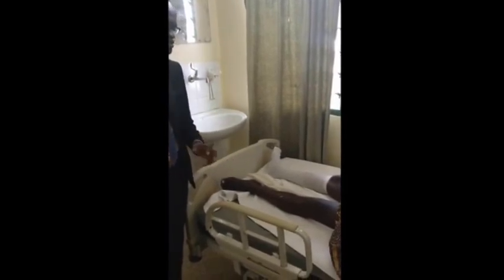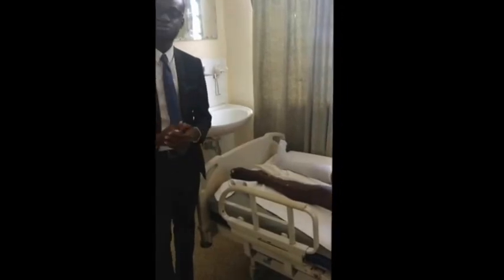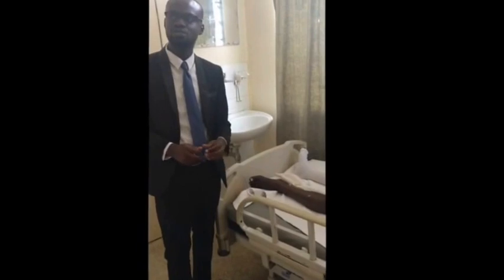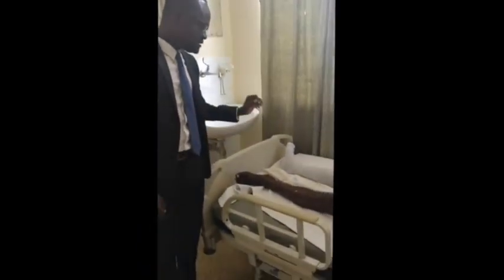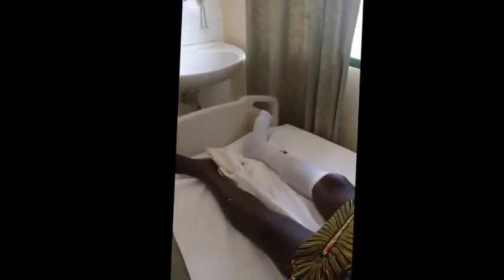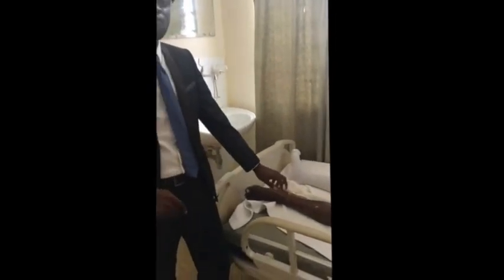In measuring, it depends on the type of anti-embolic stocking that you want to prescribe for the patient. Commonly on our wards, we prescribe the knee length anti-embolic stockings. With the knee length stockings, all that you need is the length of the leg from the heel to the bend of the knee. But importantly, the patient needs to be either sitting down or standing when checking these measurements. The patient shouldn't be lying down, because when the patient lies down, it gives an incorrect calf diameter.